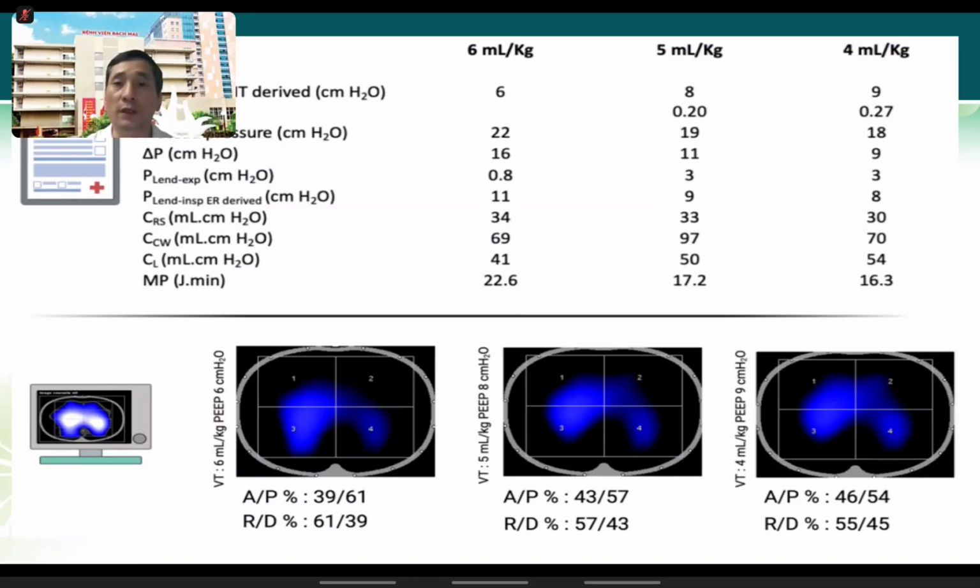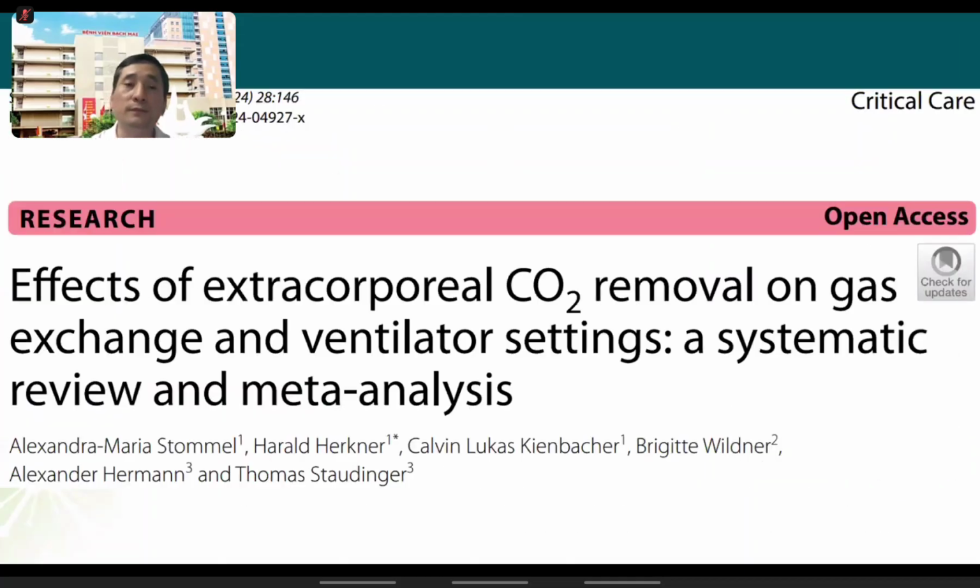When the lung collapses, you can do more by just increasing the PEEP level. But you don't know how much you can increase PEEP if you do not have any kind of measurement. So EIT can help you. For example, they see this, you just maintain the ventilation on the EIT machine. It's quite okay for the patient.